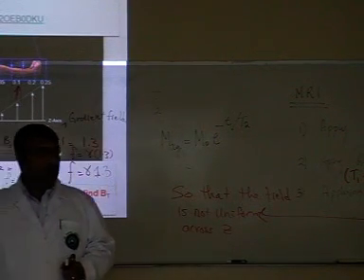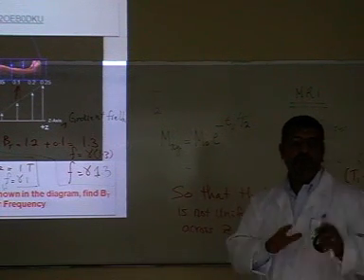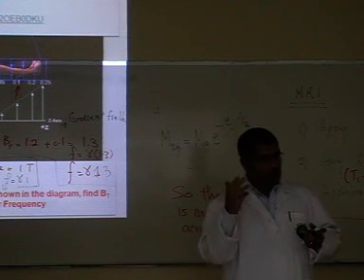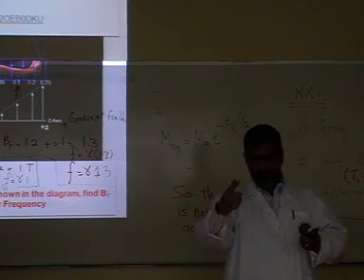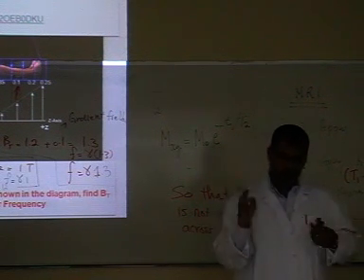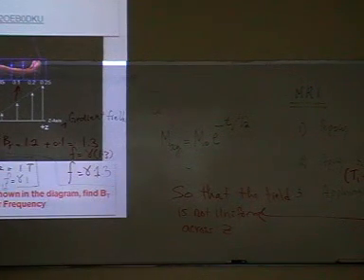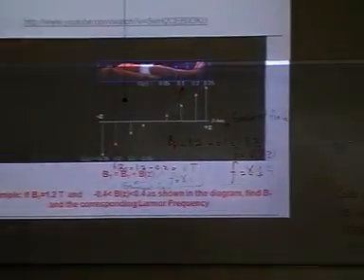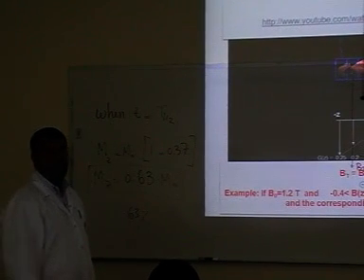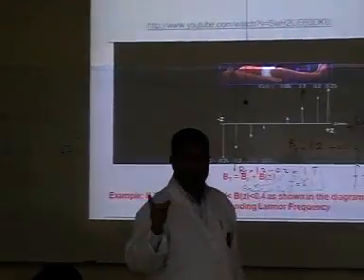How do I know it's adding or subtracting? It's very easy, engineering-wise, because a magnetic field is a vector, so it depends where it's pointing. If out of the page is positive, into the page is negative. Vectors have magnitude and direction, so that's taken care of. The add or subtract is very easy. And as I said many times, you know exactly where it is as a function of Z, and Z is the long axis. Any questions before we start?